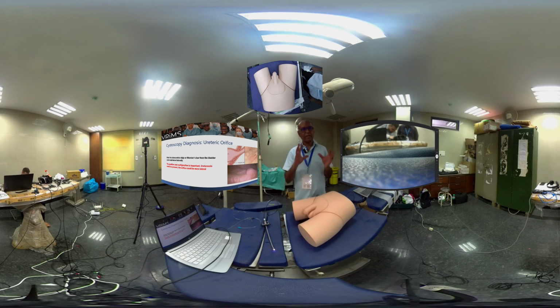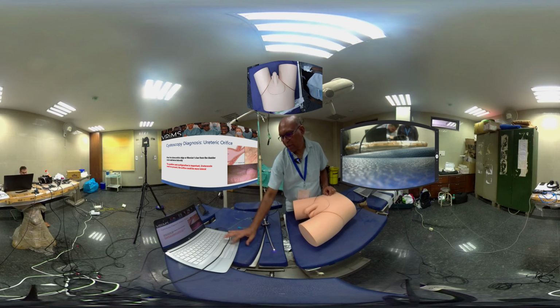And then the next important thing is to locate the ureteric orifice. From the bladder neck, if you look down, you will see the interureteric ridge, which you trace on either side, and the orifice will look like this. The diagram you can see there.